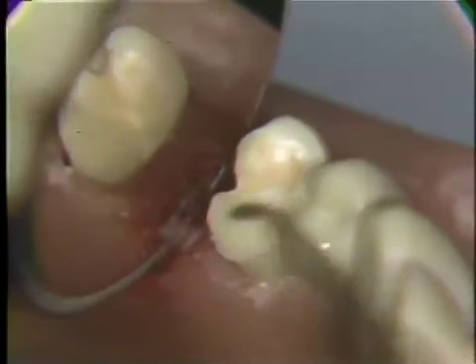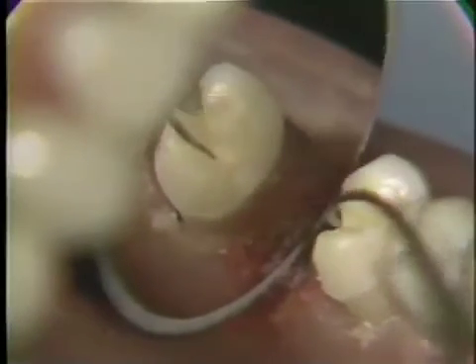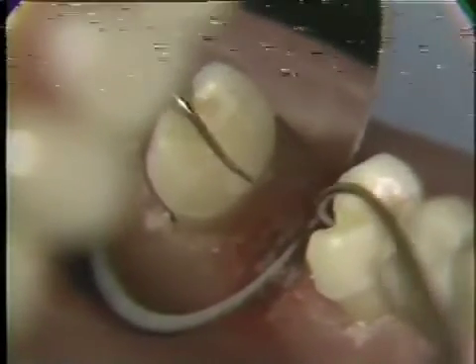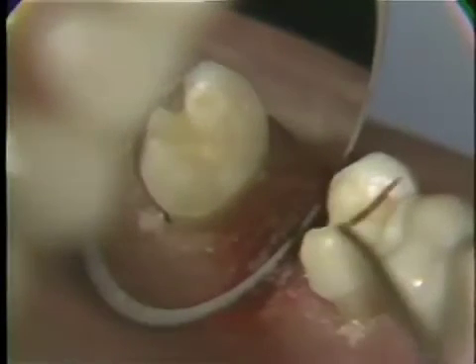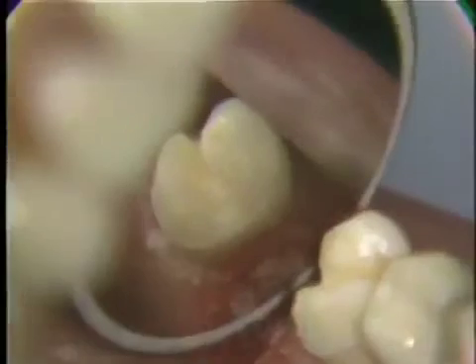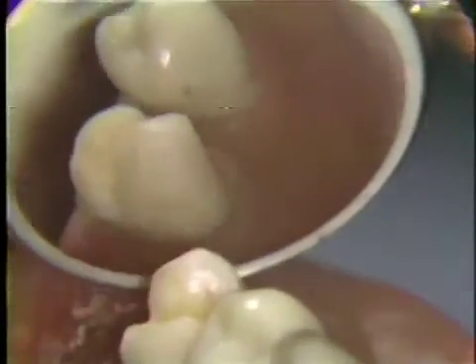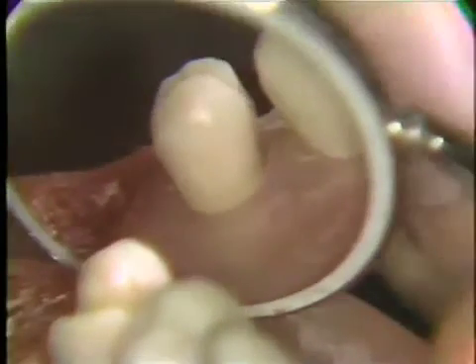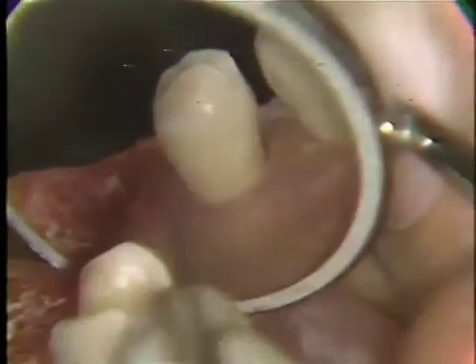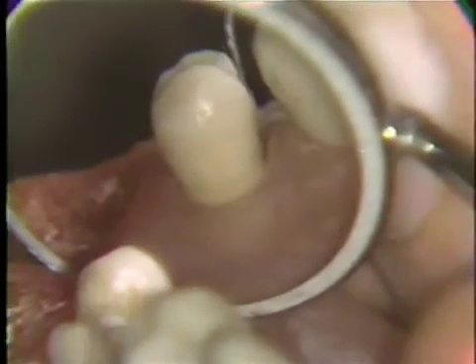You'll note that there are smooth surfaces. The finishing line is sharp, and there are sharp definite boxes on the mesial and distal with the isthmus connecting the boxes. The line angles have been rounded, there is adequate protection of the occlusal surface, the mesial surface has been opened so that a casting can be placed and an impression can be readily taken, and the buccal cusp has been adequately protected.